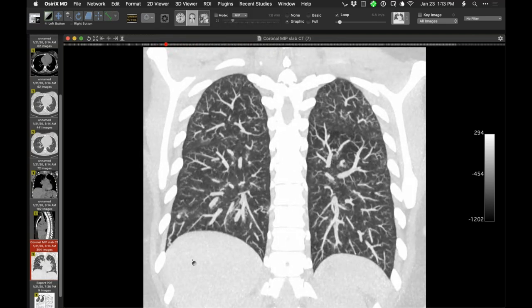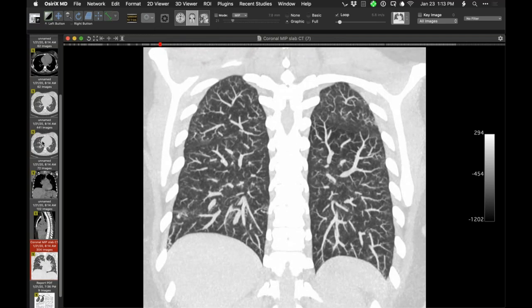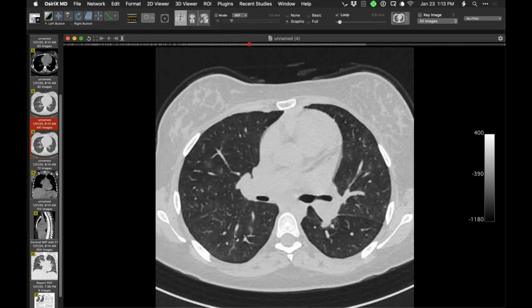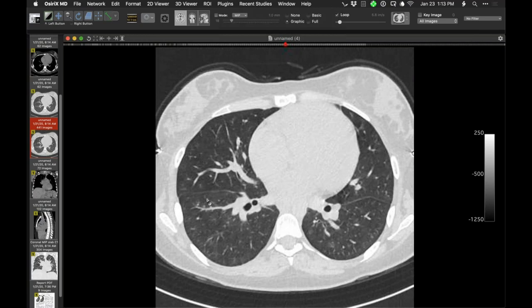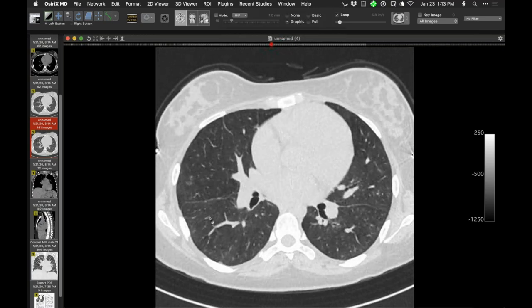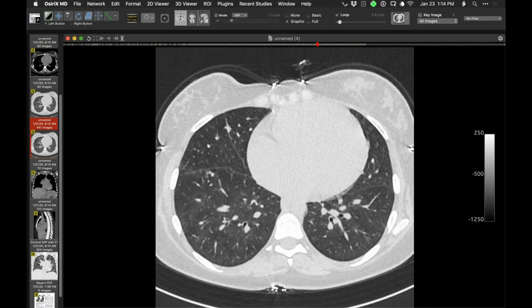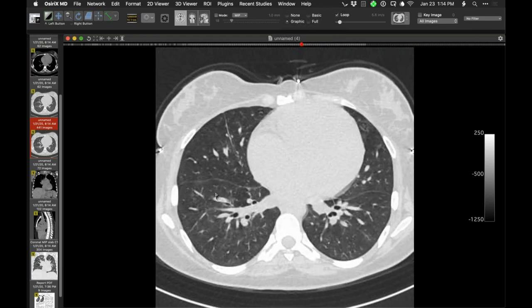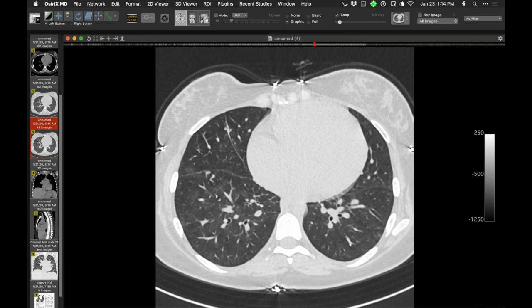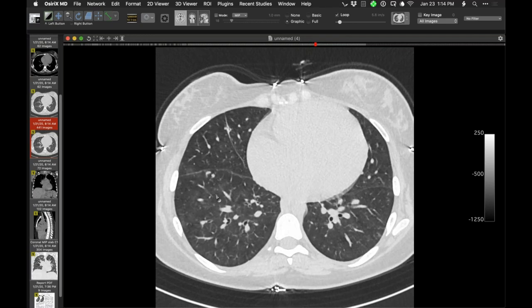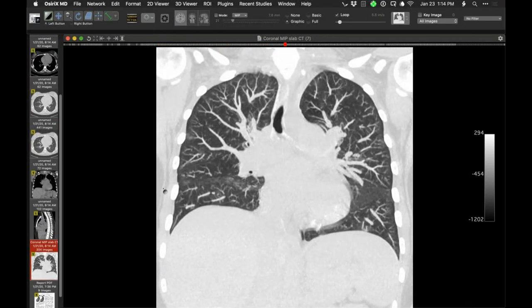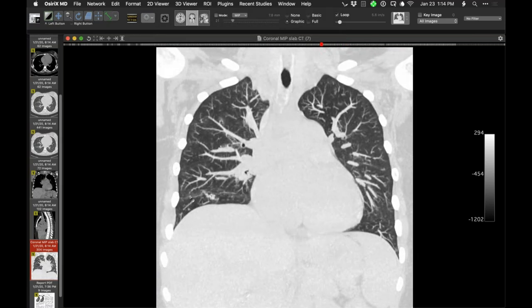Can you come back to the axials again? In the right lower lobe anteriorly near the fissure, there was one of those vessels — we were trying to figure out if there was an AVM or just a tortuous vessel. I said it was in the right middle lobe, but it's actually just behind the fissure. But that's one of those very tortuous vessels — what we saw in the right lower lobe.